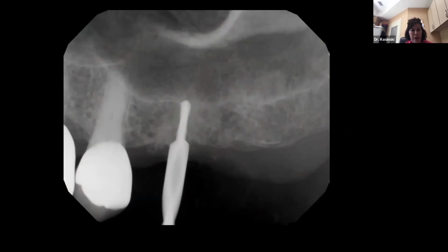A digital radiograph is made. Again, I only penetrated into the hard tissue about 4 millimeters. The Hahn surgical burrs allow me to accurately see this. I'm satisfied with my angulation and distance from the adjacent natural tooth. If I was not satisfied, I could reposition this pilot burr to achieve the placement I desire.